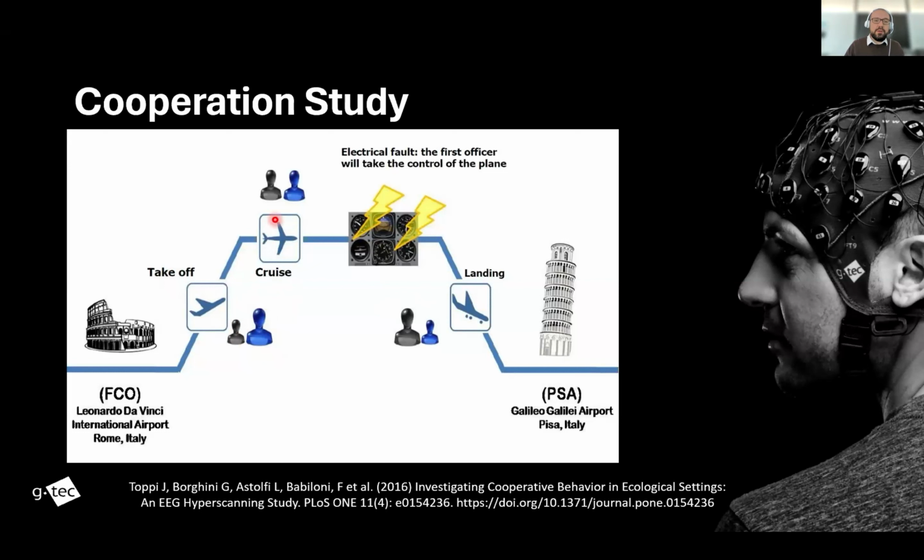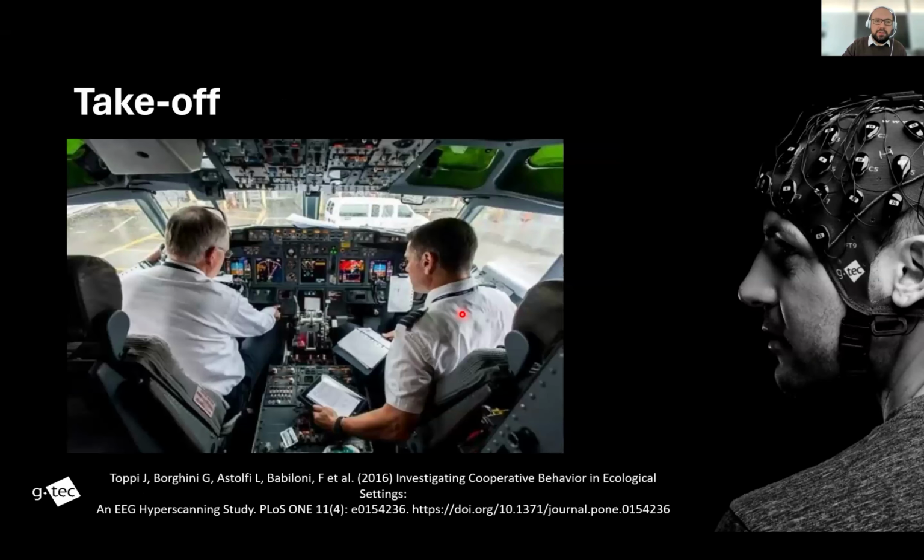From the takeoff to the cruise altitude, then there happens an electrical fault and they have to solve this issue and land on another airport. And during all this time, they were measuring brain activity.